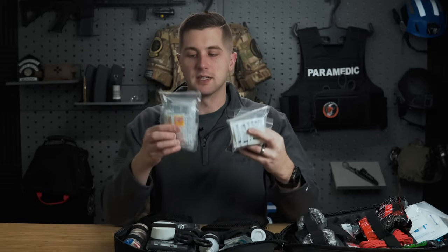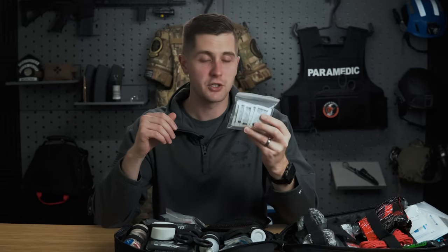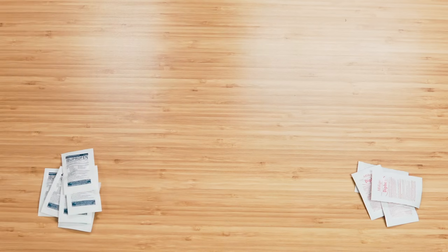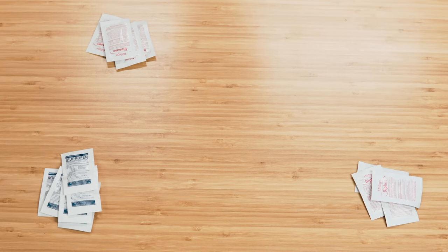And each of these has a different set of medications. So we'll start with this guy here. This one has Difen, which is diphenhydramine, just for your minor allergic reactions. And then we have ibuprofen, which is a non-steroidal anti-inflammatory, good for your pain, things like that.